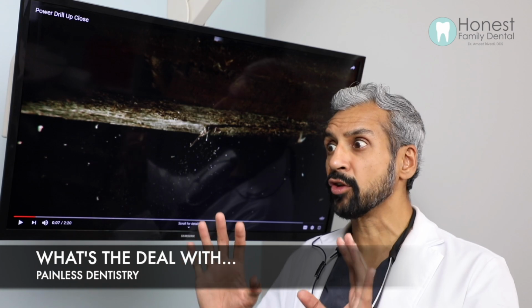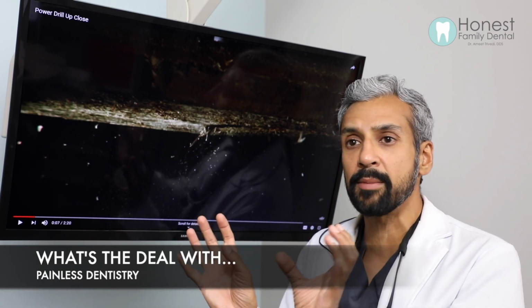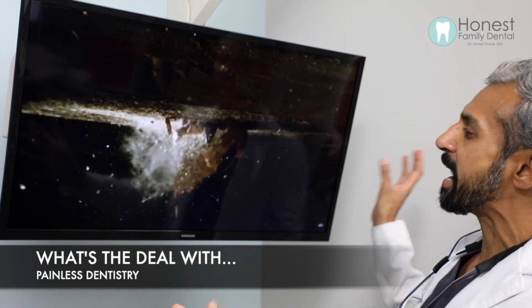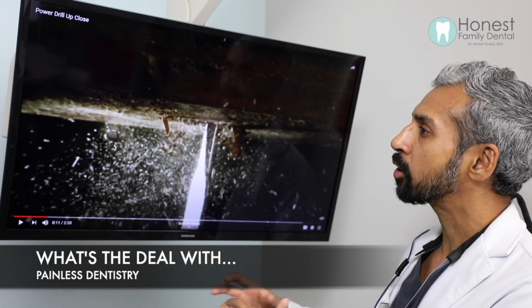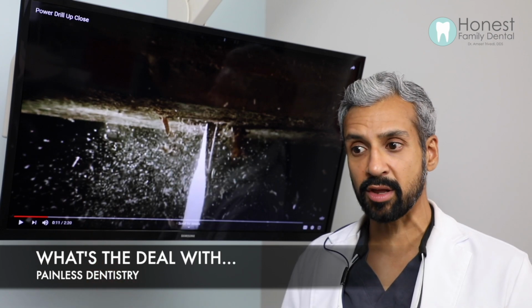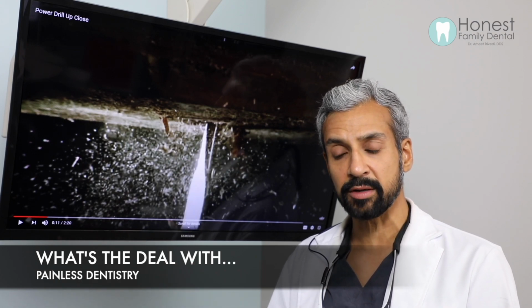So if you looked microscopically, if you were a tooth and you're looking at this drill coming at you, this is basically what it looks like. The enamel shatters out of the way. It's not cutting, it's shattering it, blowing it out of the way. And all that movement creates pain, and that's why you require a shot. And that's why after the procedure, it's sore, and you're going to be numb for 5 to 8 hours. So all these things come with the traditional method.